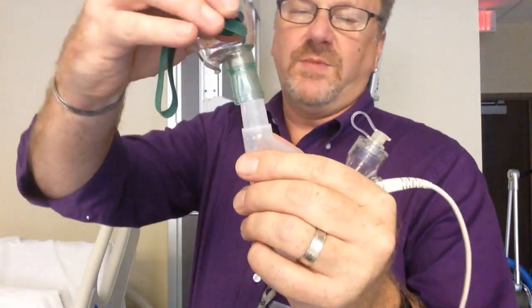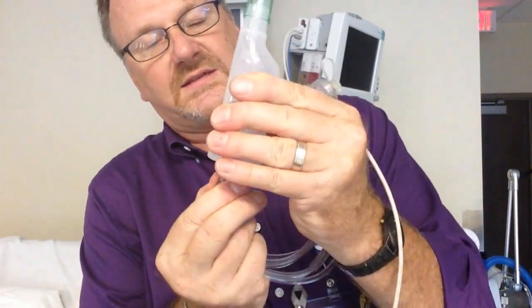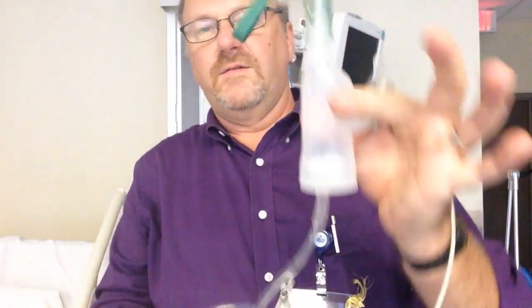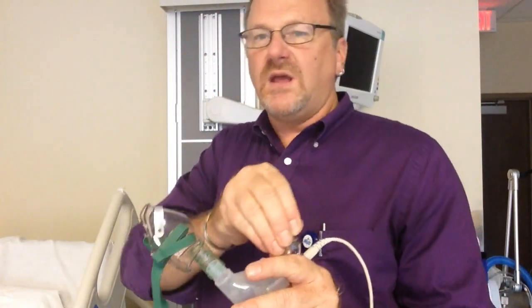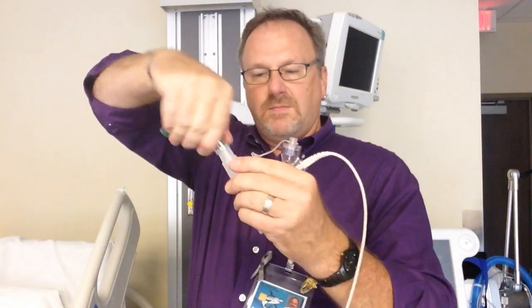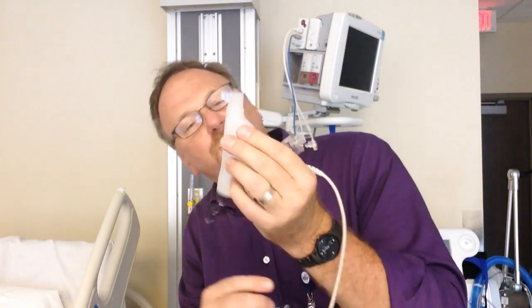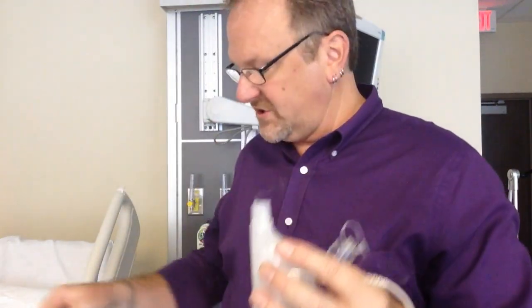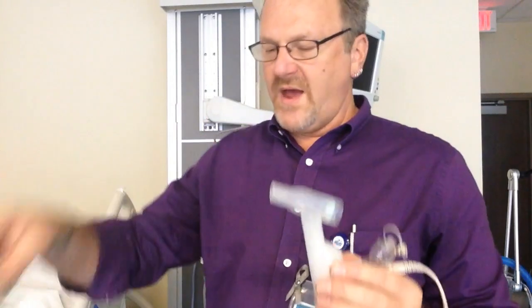If we want to use a mask treatment, we can do that too. If you use a mask, you need at least one liter per minute flushing through — that is per manufacturer standard. With a simple mask we say you need a minimum of six liters per minute, but this is per manufacturer recommendation: one liter per minute going through will help the medication get out and the patient can breathe it. So you can give the Aerogen with a mouthpiece or with a mask, but if you use a mask, you must have one liter per minute going into the bottom.